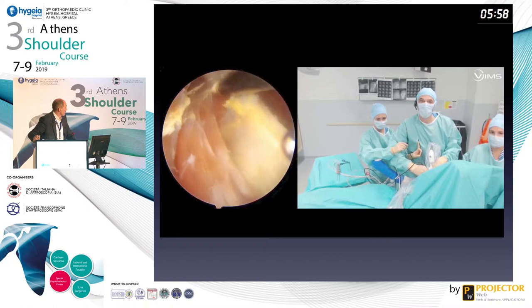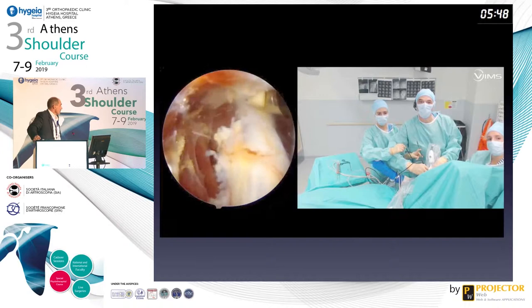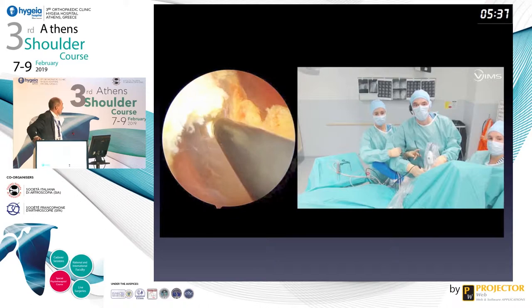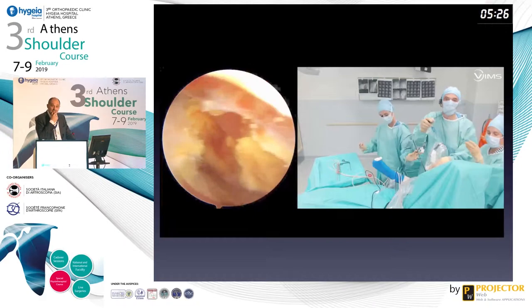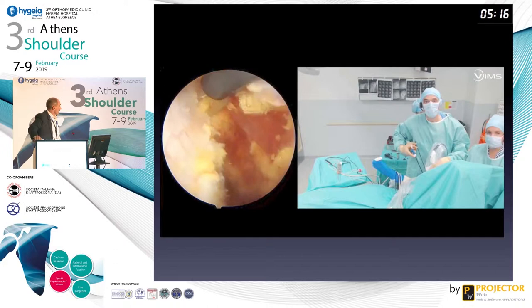And again, you have to go as deep as possible. And now you will see that my probe will be too short, and because of that, I use endoscopic scissors, which are longer. You can see the scissors in the hand of my assistant, and you continue to go as deep as possible, and it's possible to go to the scapula. I think for an anterior transfer of the lat dorsi, it's not mandatory to release the lat dorsi from the scapula, because my goal is not to reach the upper part of the humerus, but just the anterior part.